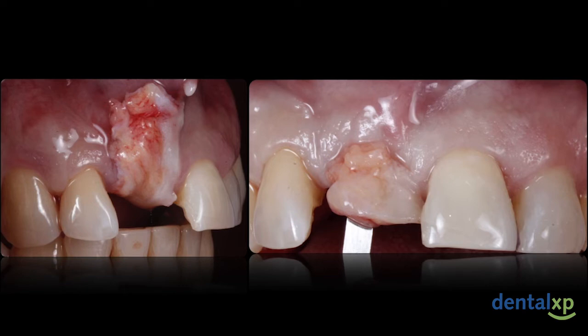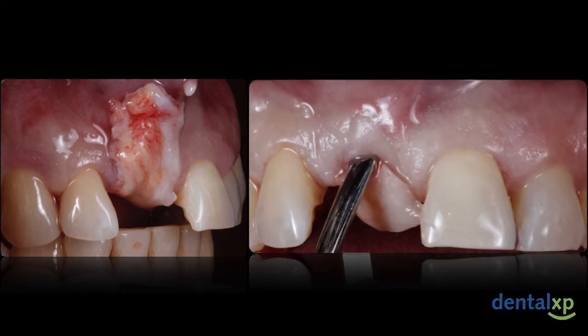So what we did here is, following introduction of the apical portion of the graft, we planned on folding the coronal portion to allow for increased thickness in the site that required the most augmentation.